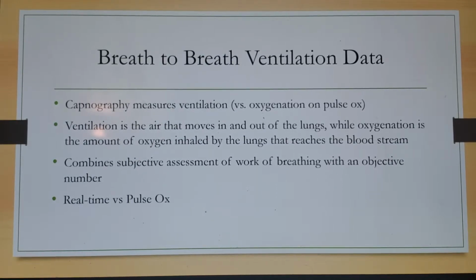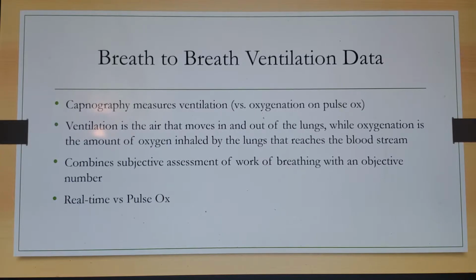And we've all seen this when we're intubating and we get the tube in and the sats stay down in the 60s for a butt puckering 10 or 15 seconds before they go back up. That's showing oxygenation. While the patient's actually ventilating, they just haven't oxygenated yet. So the more up to speed, real-time measure is your ventilation, which is reflected in your end-tidal CO2.